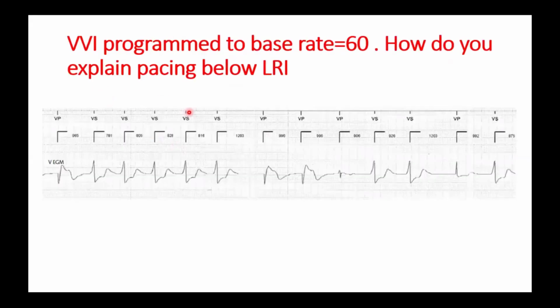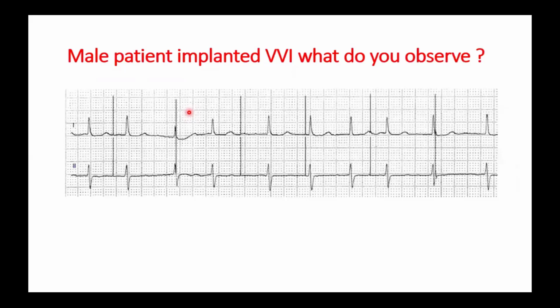Okay, Dr. Rossasy, you are going to give some examples and then we'll ask the audience to answer, yes? Okay, no problem. From the next case, I can give the slide to anyone who would like to share it, because I can see them answering in the chat group. Dr. Amr answered correctly. Let's give them just one second to think, and then we will give the answer.